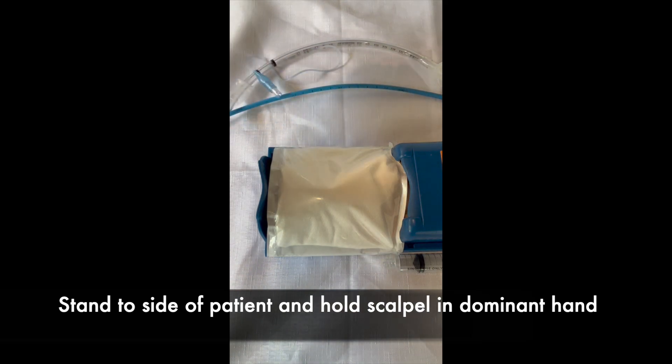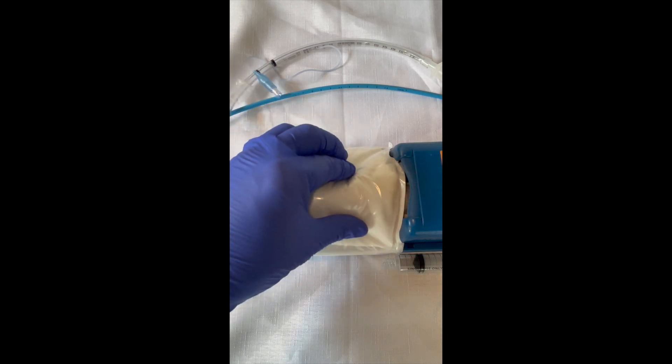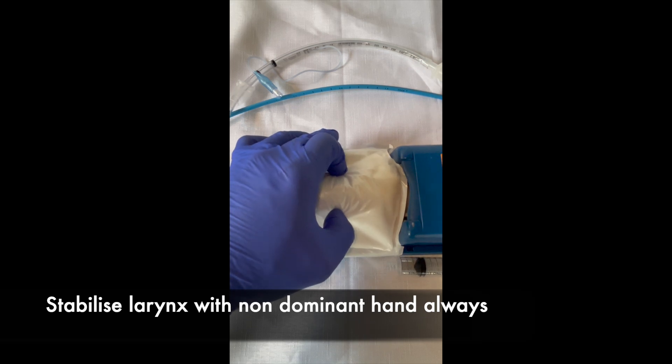The procedure for cricothyroidotomy using the scalpel-finger-bougie technique is to stabilise the larynx with your non-dominant hand. There's still some lateral movement of the larynx.